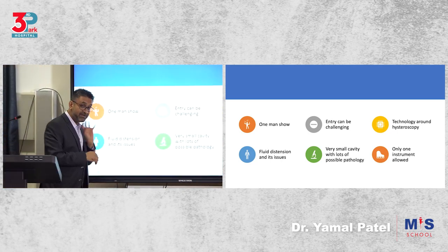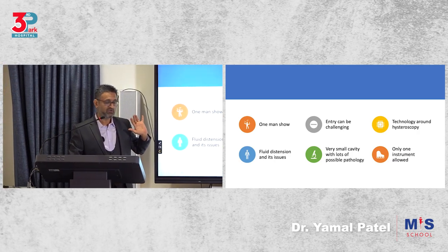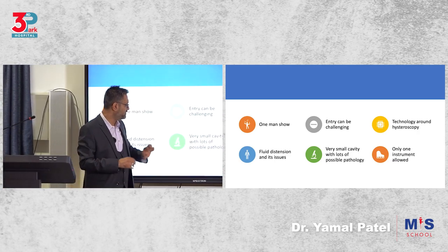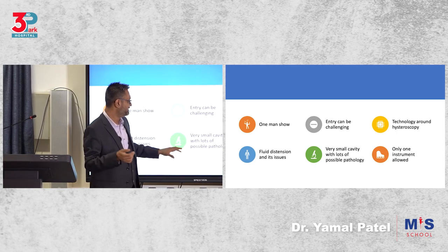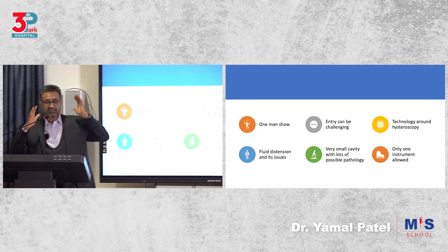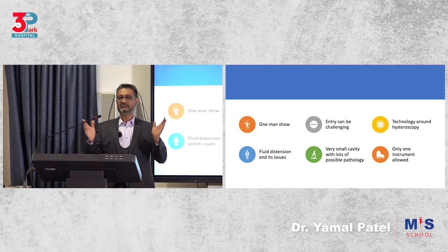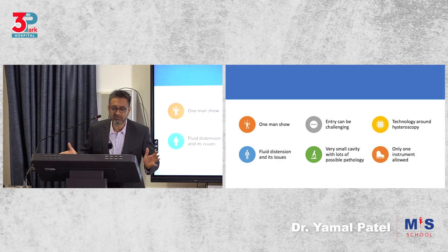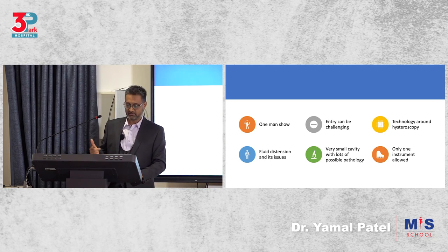You need to know fluid, its distension mechanisms, and its issues of overload. You need to know you're going to be working with a very small cavity with lots of possible pathology, and only one instrument is operating at any given time. So these are issues you need to learn about hysteroscopy. It's not, I just need to know how to do hysteroscopy. If you don't know that this is what's going to be required, what will you do?